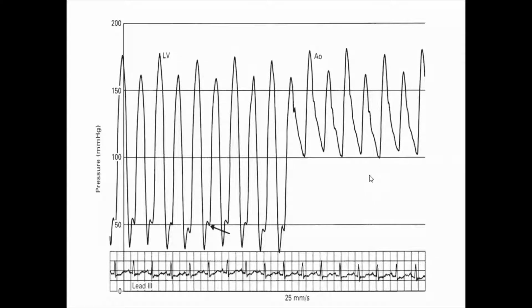So what is your diagnosis? Severe LV systolic dysfunction causing pulsus alternus, sinus tachycardia, and high LV EDP.